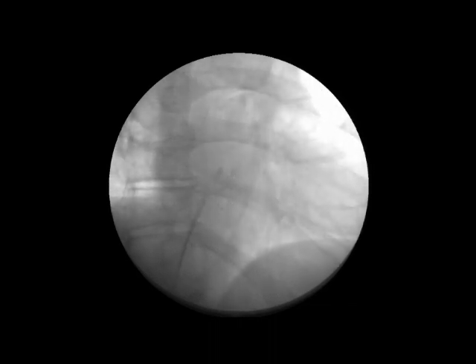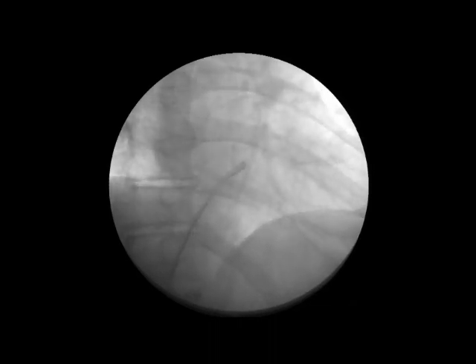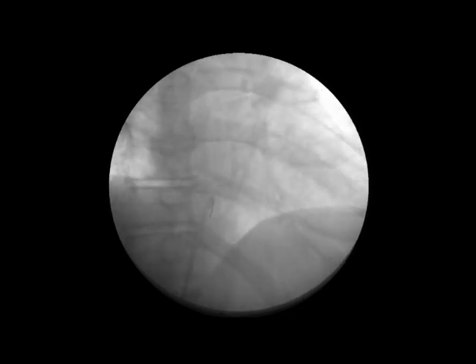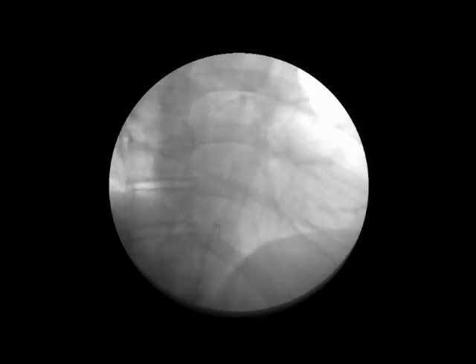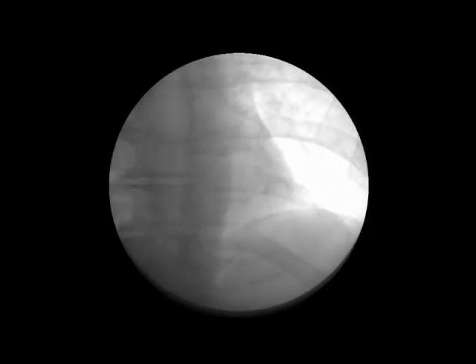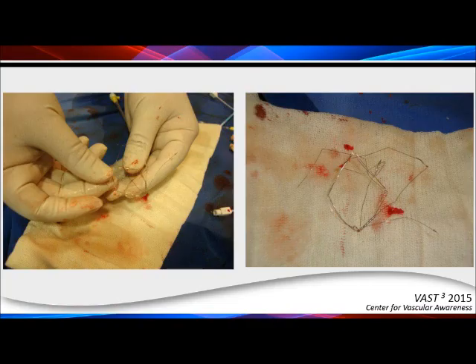On the tricuspid valve, we decided to use the endovascular approach to retrieve the filter, and you can see the same retrieval set, the catheter and the snare, and we took the hook of the filter in this position and we pulled down the catheter to the groin, and the filter was inside the catheter.